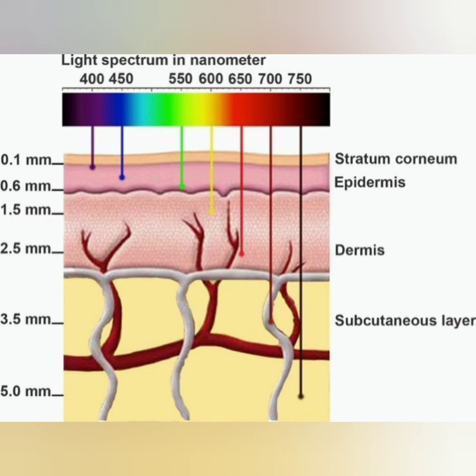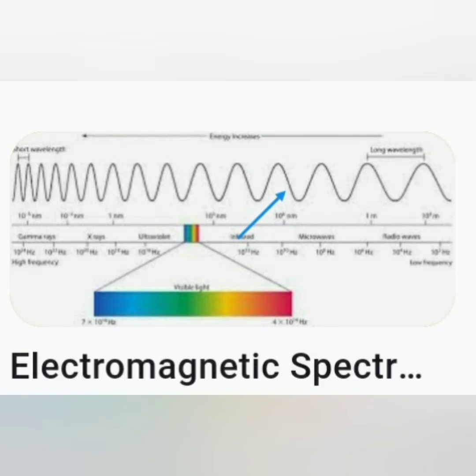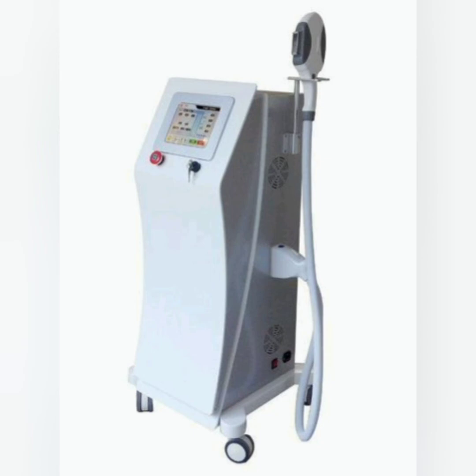Examples of pulse light machine flexibility include: pulse light delivers wavelengths from 500 to 1200 nanometer, while a laser can deliver only one wavelength at one time. Now this IPL has more advantages and a wider scope of use because it has different filters using different wavelengths, whereas mostly other lasers have only one wavelength at one time. So IPL can deliver wavelengths from 500 to 1200 nanometer.